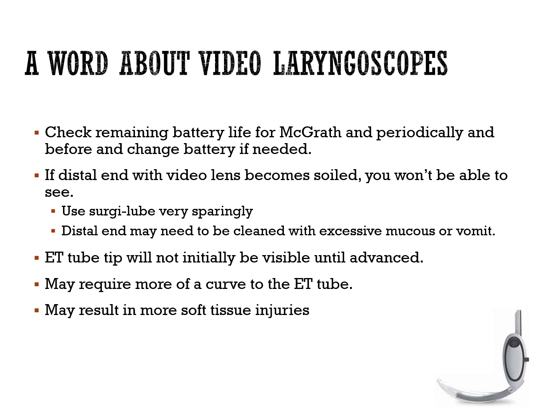UE, the two letters UE, makes them. McGrath is a very popular handheld model. Ambu makes them. GlideScope makes them as well. The Ambu and the GlideScopes tend to have a tower, and the scope itself is connected to the tower, which has a monitor on it, via a cable. I'll talk a little bit about the advantages and disadvantages of that cable approach. But irrespective of what type of video laryngoscope you use, they are becoming the standard of care.